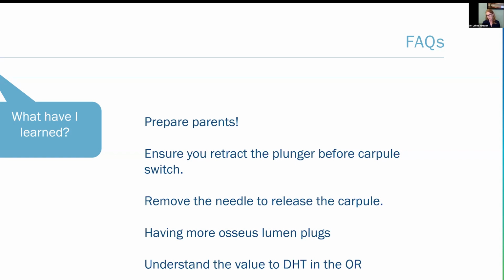I just want to give you a heads up. We have the state-of-the-art way of delivering local anesthesia here. But it does take longer because it's a digital delivery, which makes it virtually painless. And we're going to sit, and we're going to talk, and we're going to hang out.